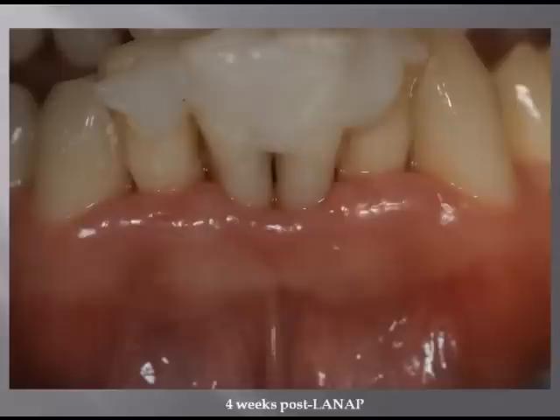Here he is four weeks post-LANAP. Look how nice that tissue looks. He has beautiful margins. Tissue inflammation has come down. He's very maintainable. I'm a periodontist, so I don't profess to do perfect splints here, but it accomplished the job we wanted it to do.